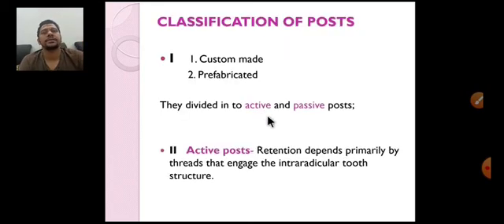To explain this, I'll give an example. I hope everybody is familiar with drills, with which we can make a space in walls in order to keep a screw. Drill bits and drilling machine, I hope all are familiar with. When you make a drill hole in a particular wall, let's imagine you made a drill hole of 5 millimeter in diameter with a drilling machine.